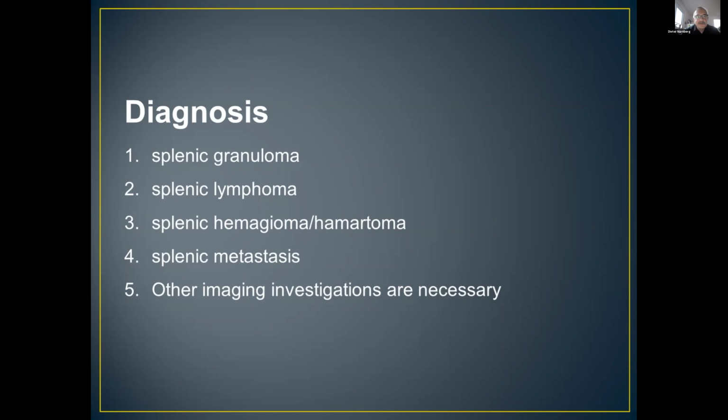Thank you very much. It's very interesting. It's not of clinical importance, because we have a metastatic liver, but we can learn about the different flow in the lesions.